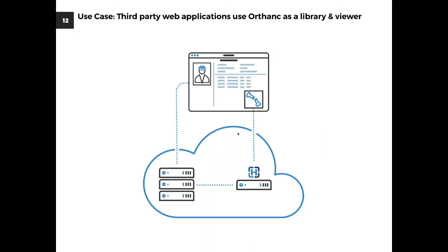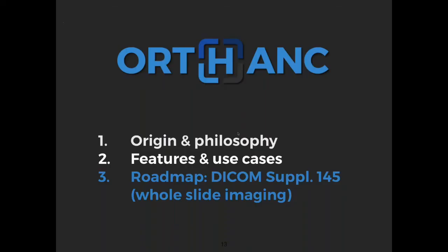Orthanc is running in many web applications where it can basically be used as a separate library to store and visualize medical images.